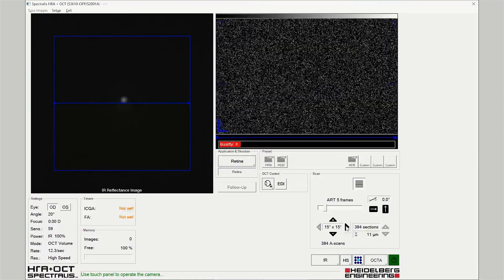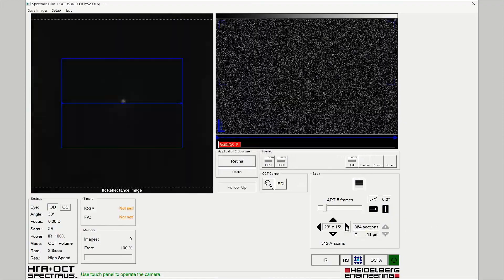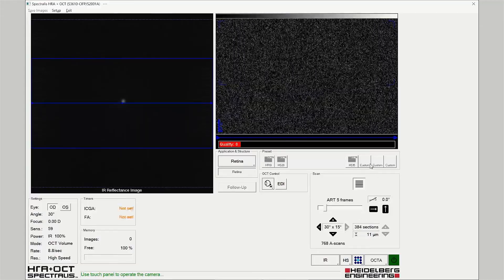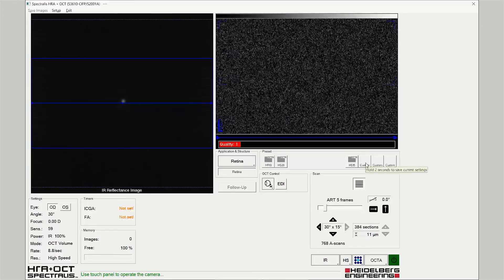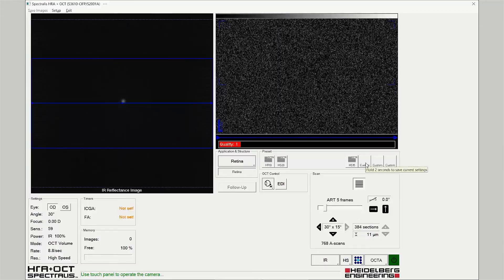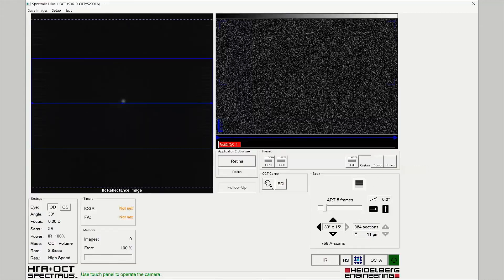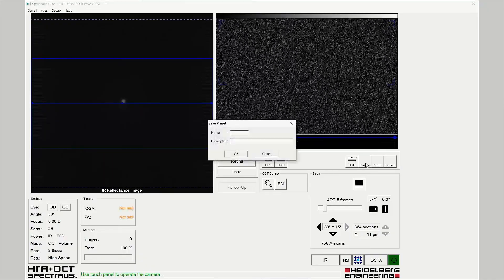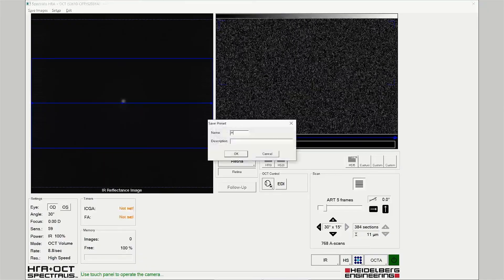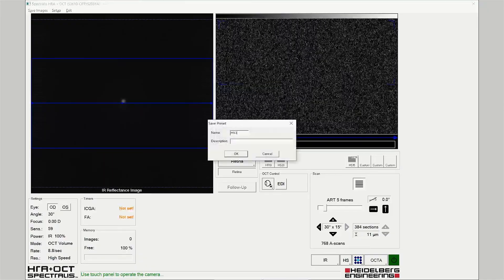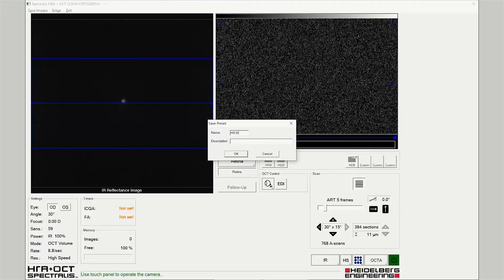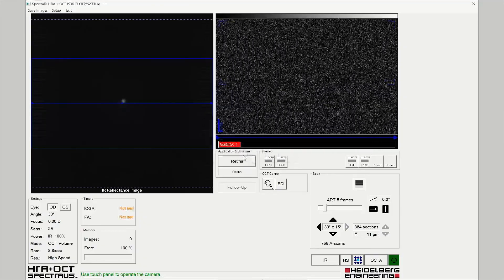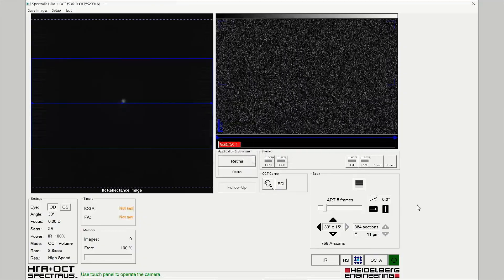Extend the width of the scan field to 30 degrees. Click and hold the custom scan button, name the scan pattern as 'High Speed 30', and click OK to save the custom scan pattern.